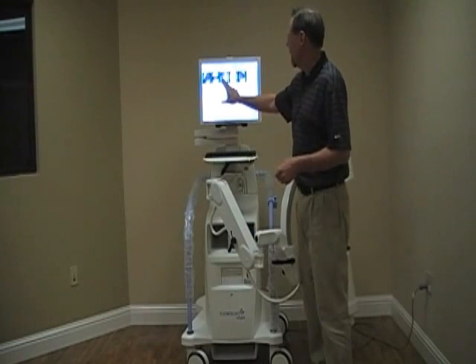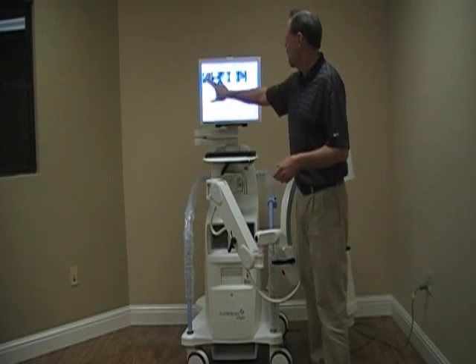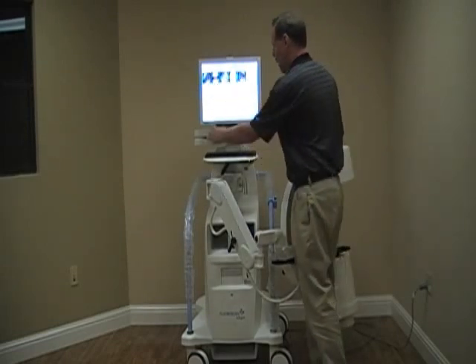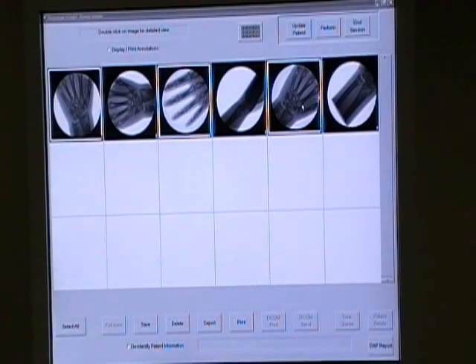We can select any of those images. In a Windows operating environment, if we want images 1, 3, and 5, we hold the Control button down and hit 1, 3, and 5 — it'll allow us to select those images, indicated by white boxes around them. If we hit Print, it's going to print off that strip of three pictures. If we hit Save, it's going to save those three pictures as well.